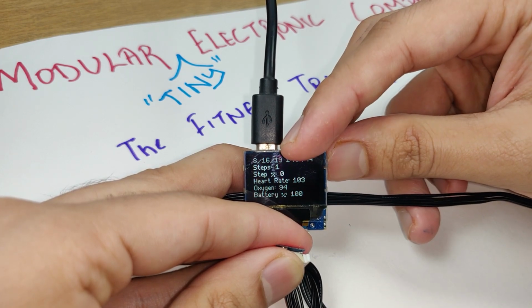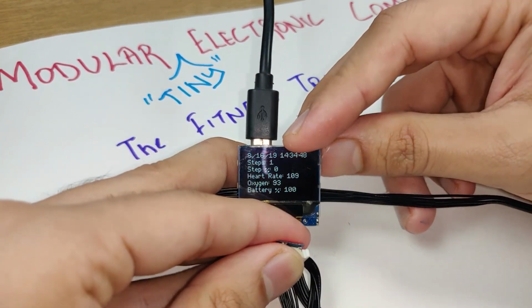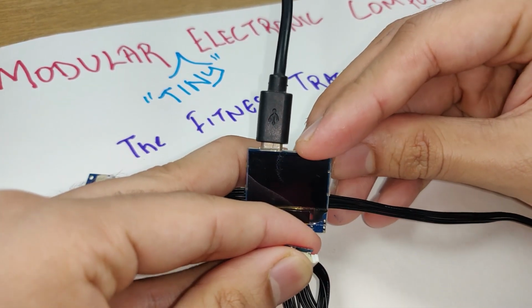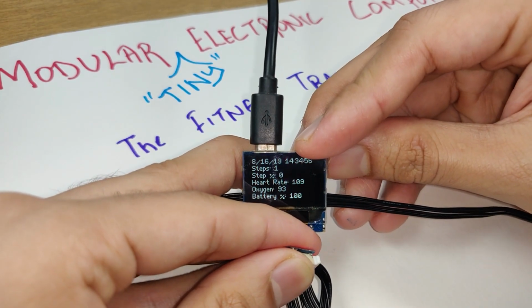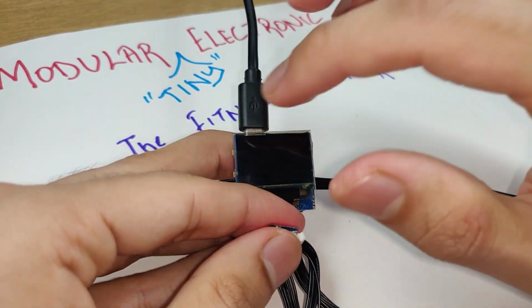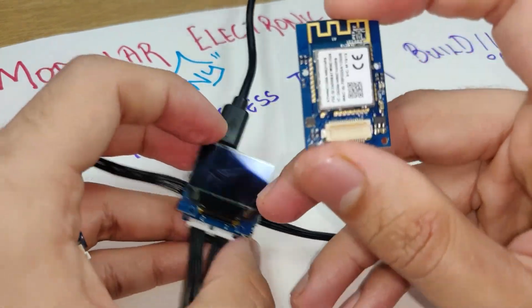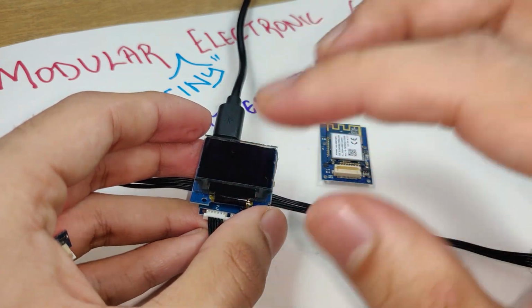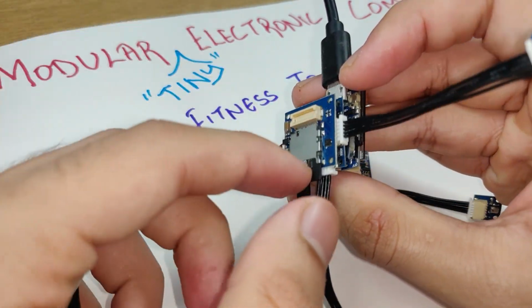The threshold that we have set is pretty low right now, so with a slight movement of the accelerometer, it detects as a step. We need to tweak this value in the code to set the threshold so that the step is detected properly. And that is how we have the fitness tracker. You can slap in the Wi-Fi module onto back of this module over here, so that you can upload the data to the cloud. Right now we have the micro SD card shield attached to it.